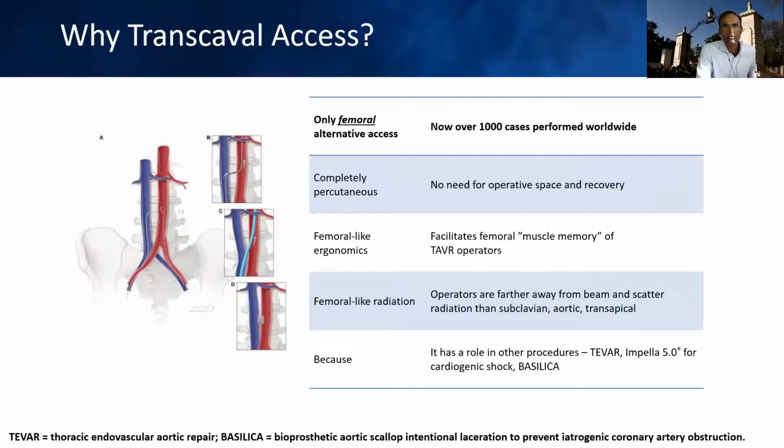Within our Emory group, we do feel that transcaval allows us to maintain femoral workflow and some of the muscle memory that we have as operators in performing these procedures and trying to maximize the benefits that we have seen with the transfemoral approach. Similar to a percutaneous transaxillary approach, this is completely percutaneous, and can be done within the same operating space that is used for routine transfemoral cases.